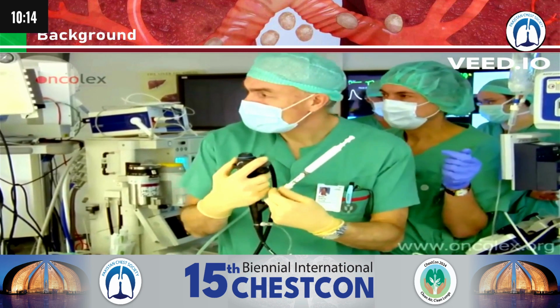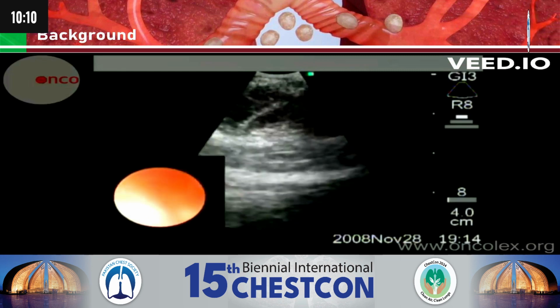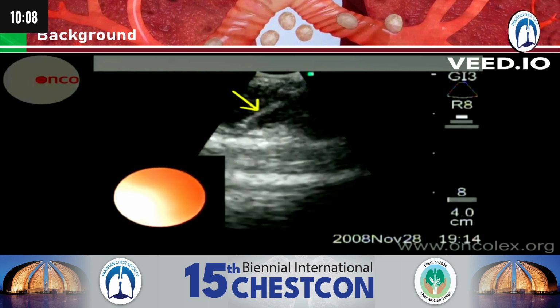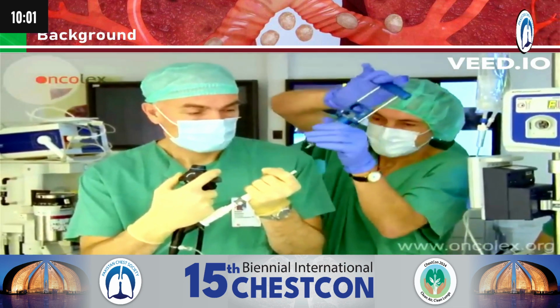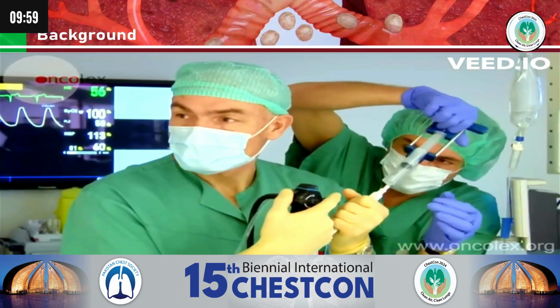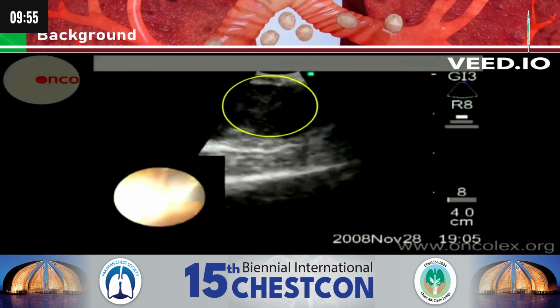Guided by ultrasound, the needle is inserted into the lymph node. This is the needle in the lymph node. The introducer is removed from the needle. Using a syringe, the operator aspirates while simultaneously moving the needle back and forth in the lymph node.